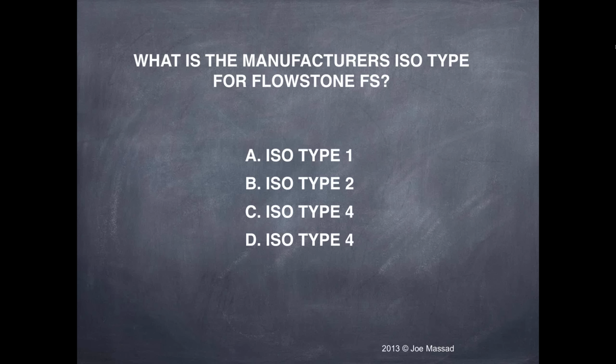Now, when the manufacturer gives you their 0.08% expansion contraction, I really believe, and this is anecdotal because I don't have any science behind it, that when you're in a total container of 4 walls, you will probably improve the ratio there. You're probably going to be more accurate, because the way they generally test that is with an open surface on either side. But for me, it's just so much easier than trying to fool with the shorter little pieces that already come pre-made and trying to stack them up.